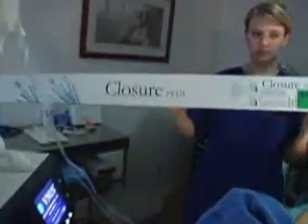About three years ago it came to my attention that there was a new way to do it. And this is quite possibly the neatest thing that's come along in vein surgery that I've ever heard of. It's called a venous closure procedure.